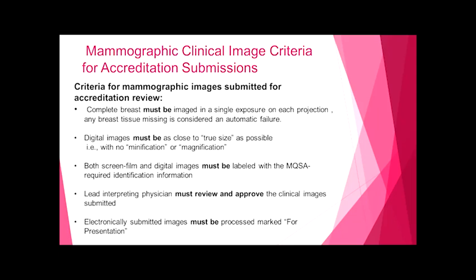So there's some of the fine line of once you select your images that you're going to be able to submit. And in reaccreditation, you do get to select your images. Now, if you get into a situation where you're in a random audit review or an additional audit where they're asking you, they've seen some things on your initial clinical images that they were uncomfortable with, and they may do an AMR, an additional medical review, and they may say, we want films from this date to that date.